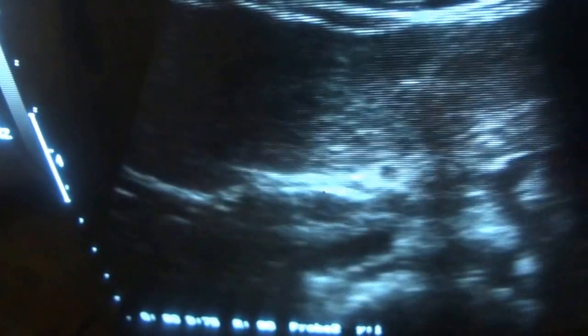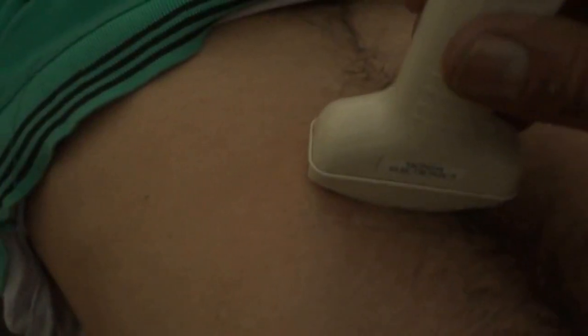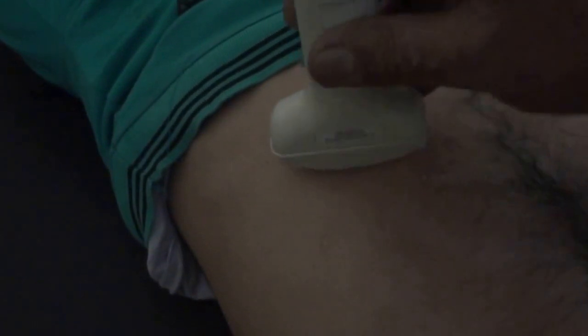This is the region of porta hepatis, this is my angle, the transducer angle. Now I am going to move the probe upwards, keeping it in this direction, and I will be in the intercostal space. From here I will angle the probe this way or this way, wherever I can get the whole length of the portal vein.